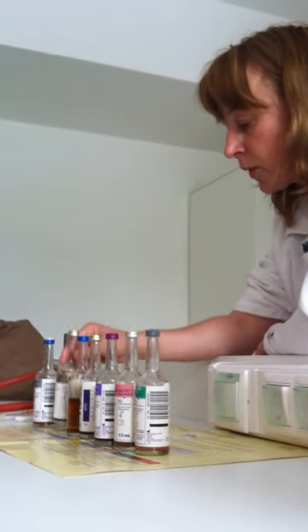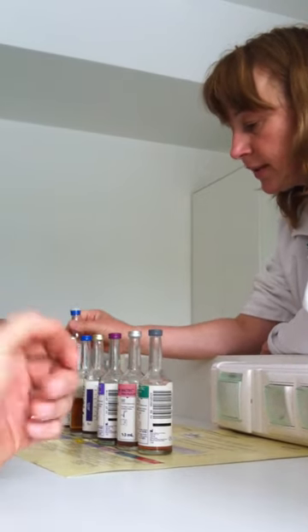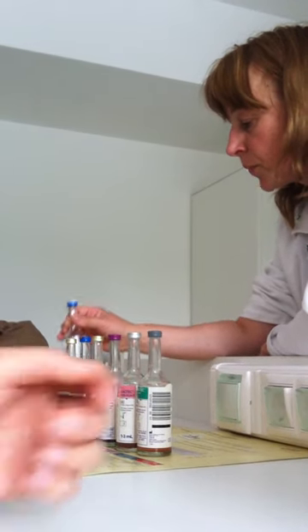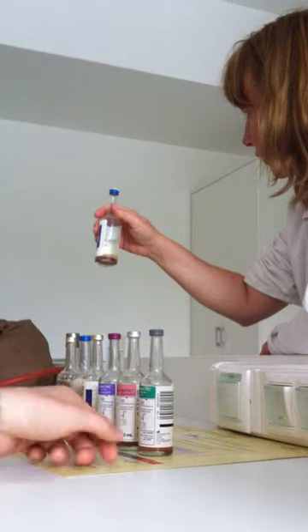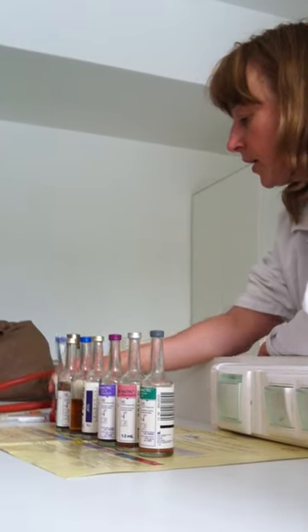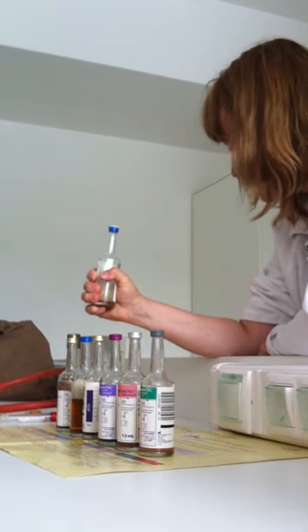So before collection, because usually you should keep these bottles in the refrigerator, you should remove them from the refrigerator and keep them at room temperature for approximately an hour, because they should be at room temperature, not cold.